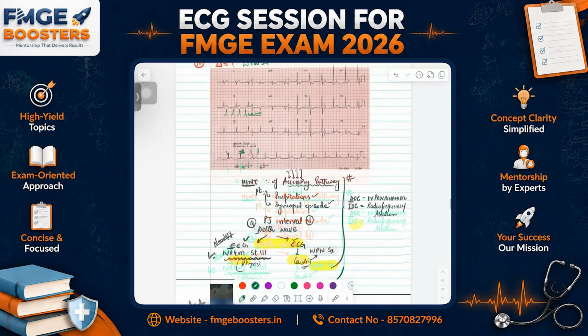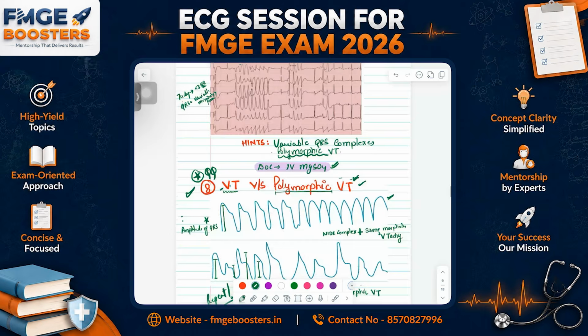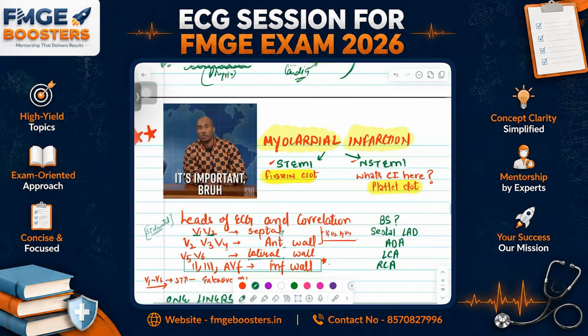Right? चलो. Guys, यहाँ तक was the most important ECGs. Like, those are very different and they have different morphologies too. But now we are going to start a very important topic, which is myocardial infarction. And I hope you know this is important. है ना? चलो, let's talk about it. अभी myocardial infarction is of two types. ठीक है? We have either STEMI and we have non-STEMI ones.